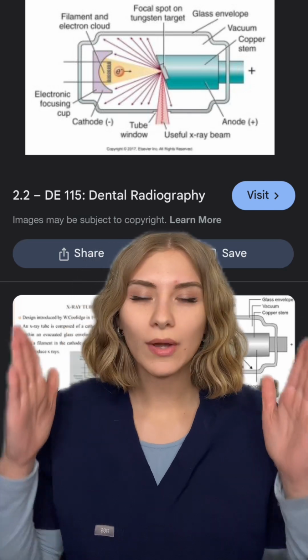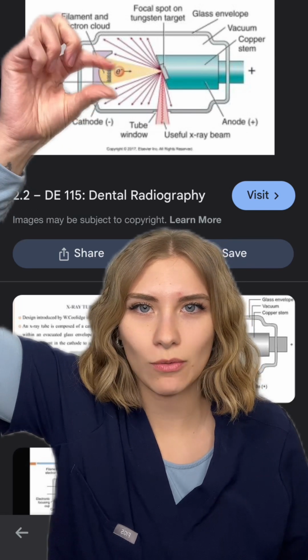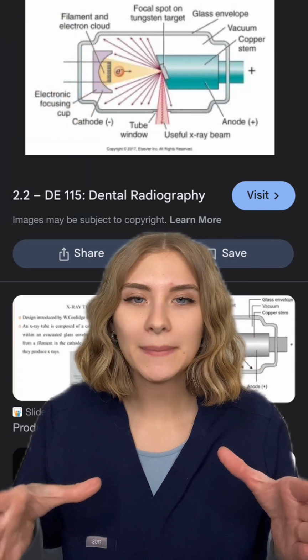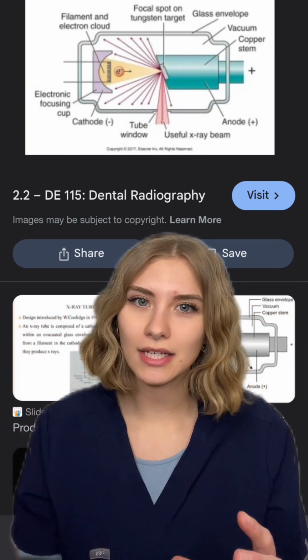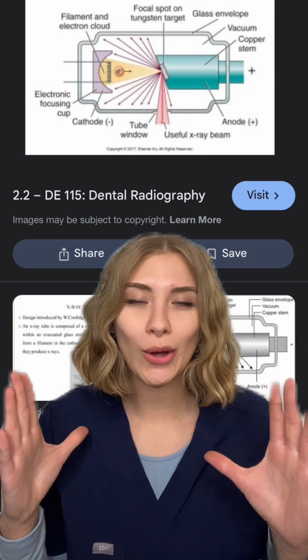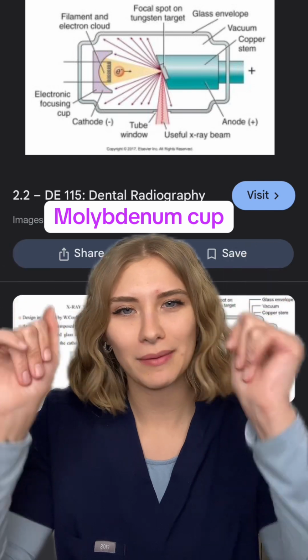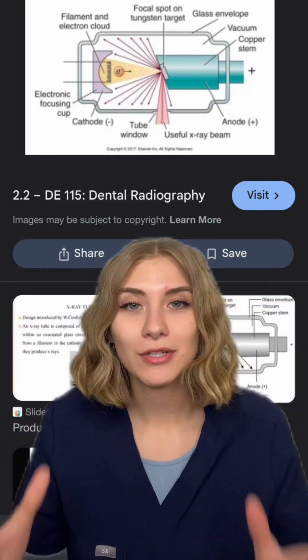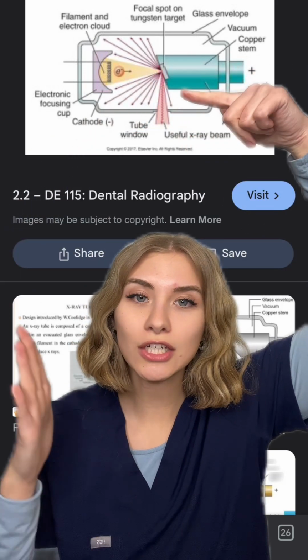I don't know. So in the cathode, there are these tungsten filaments, these little wires right here. And what happens is it basically heats up and creates negative electrons. And then this thing, the molybdenum focusing cup, I don't know how to say it, but I'll put it in the caption. The focusing cup directs that to this anode that has a tungsten target.